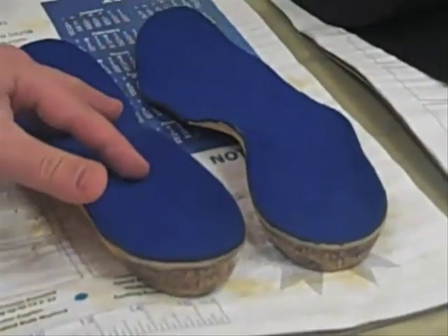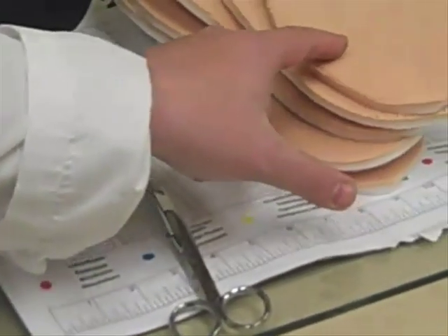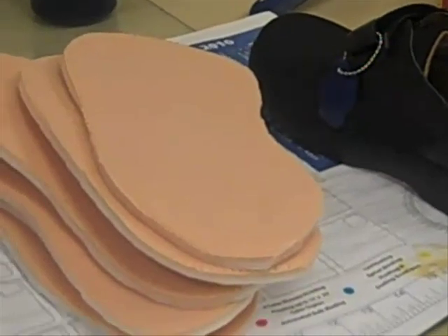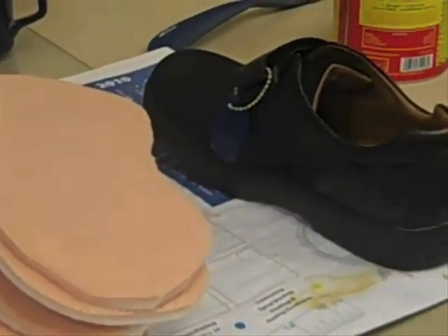This one has a sports top cover, and this one here, which is in the process of being made, is entirely made of foam for a diabetic shoe.